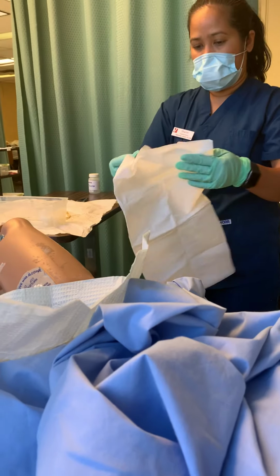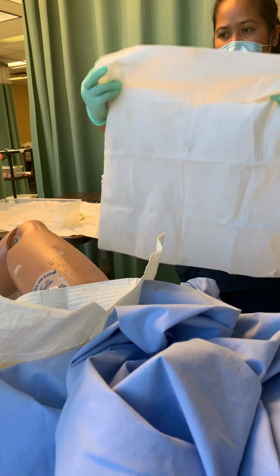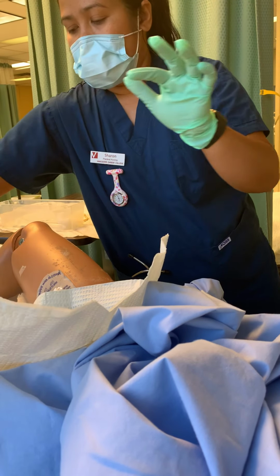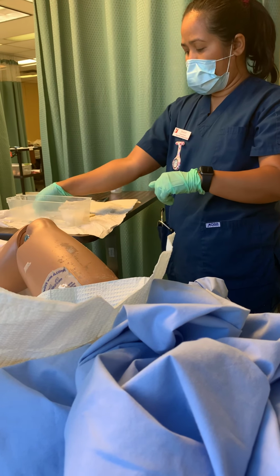Shiny side. I think I have the wrong side. It's hard to find the shiny side. So make sure to be careful. Do not touch the legs. Touch in the middle. Okay. Now I have to lubricate my catheter.